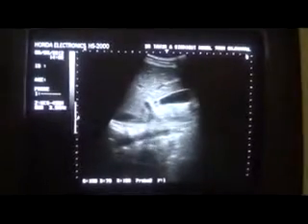Patient in supine posture. Now you will place the probe available. You will get this with patient supine and placing the probe just above the intercostal space in the sixth or seventh intercostal space. This is the subcostal region, and this is the intercostal space, and then you angle the probe a bit.